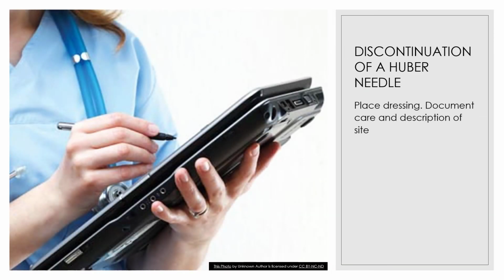Place a dressing over the site, document the care, and describe the site.